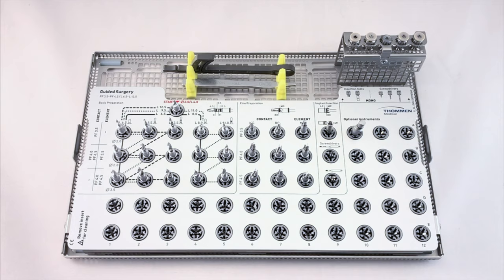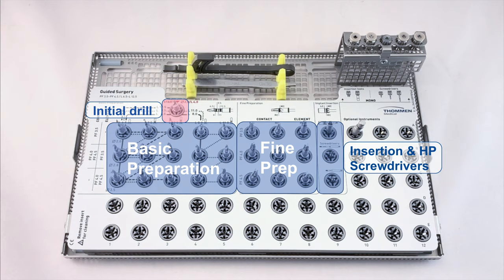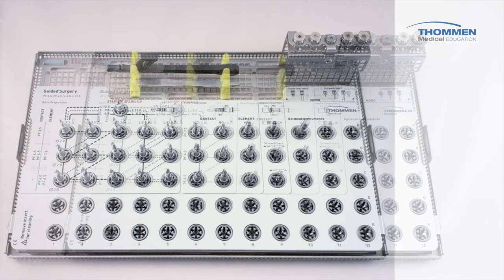We start with the location of the initial drill, which starts every procedure. We then move to the basic preparation with VectorDrills. Just to the right are fine preparation drills for profiling. In the same area you will find the screwdrivers for handpiece and the guided insertion adapter. The mono-torque ratchet and mono instruments are along the top.